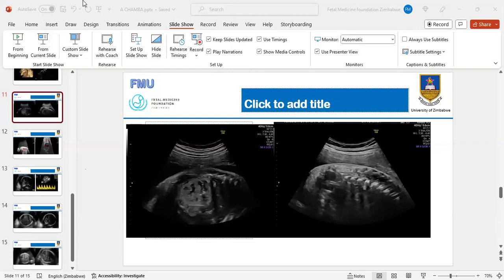If you have a small head, especially an extremely small head, less than the third centile, it is likely that there is something serious or an underlying chromosome abnormality. So this case should be referred to the fetal defects clinic. Small heads are normally found with chromosome abnormalities which we are highlighting, like trisomy 18 and trisomy 13. You tend to get small heads. We may also get microcephaly.